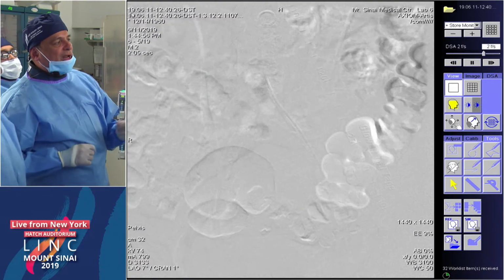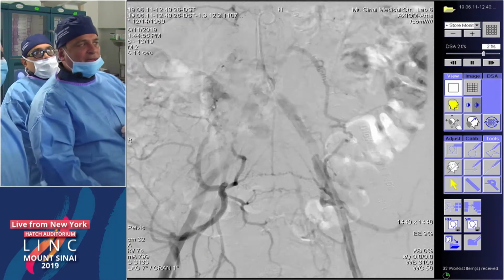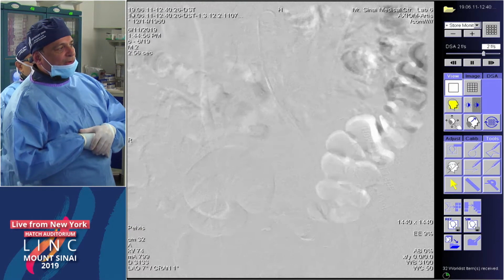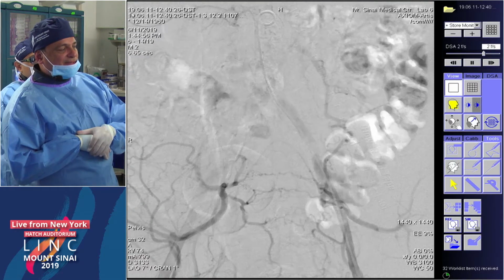So the question is, what I'm concerned about by looking at this, Dirk, and I don't know who else is on the panel, maybe Dr. Anbar is on the panel as well, is that distal aortic lesion at the base of the distal aorta. I'm worried that I may disrupt that into the aorta if I go ahead and place a stent.